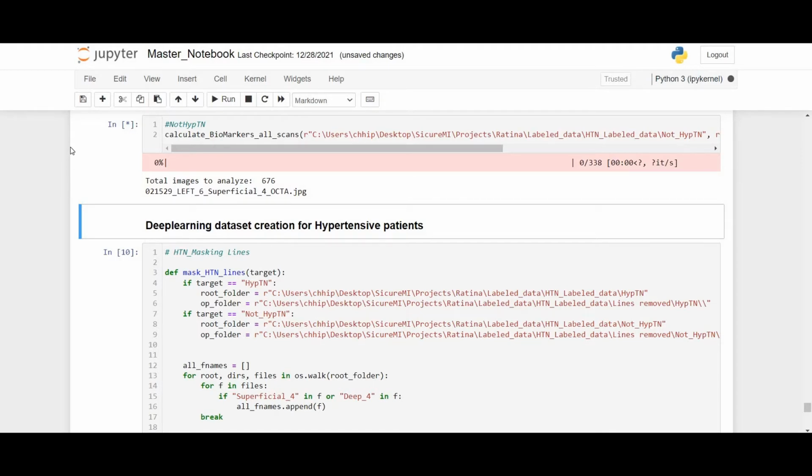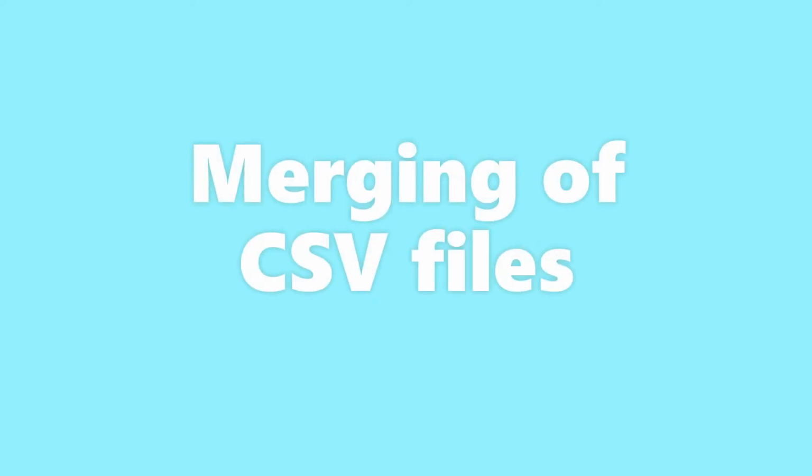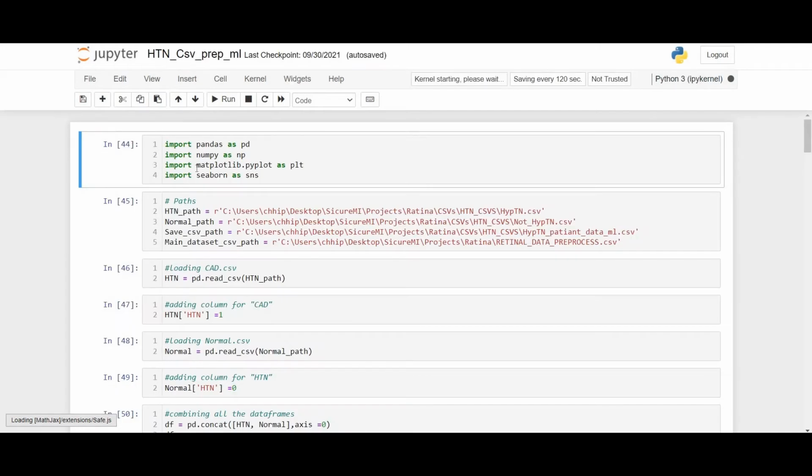Now the biomarkers have been calculated. We have got two CSV files named hyptn.csv and not_hyptn.csv in the htn_csv folder in the Retina project directory. Now to merge both the CSV files we need to run the code in htn_csv_prep_ml notebook. Please make sure to input the correct input file path for error-free execution of code.